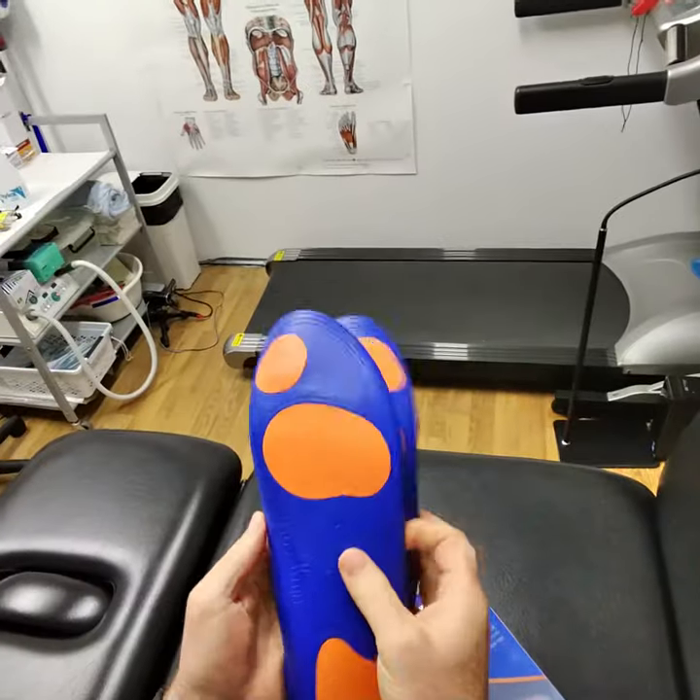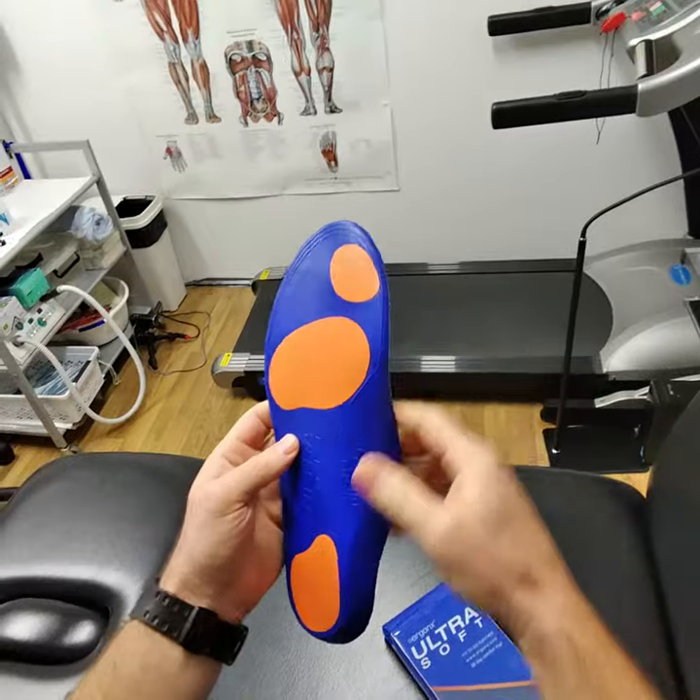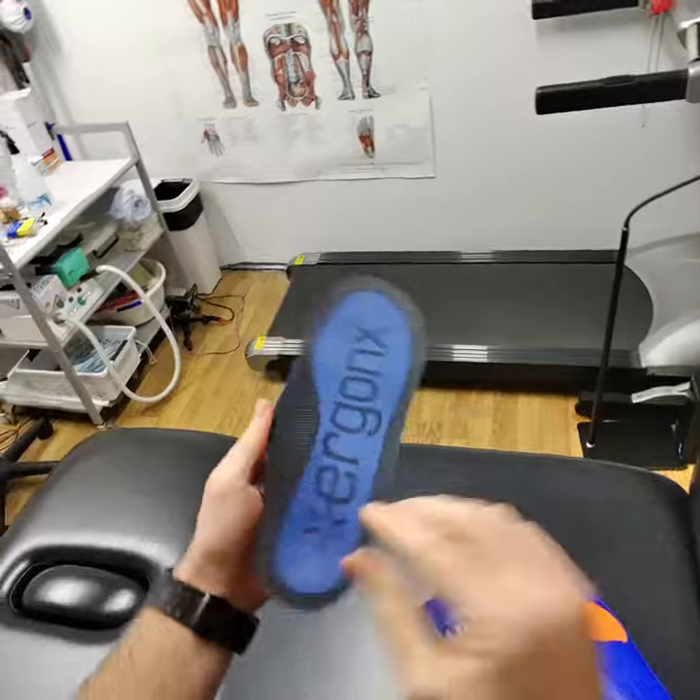You can see they look just like the picture on the back. They've got the forefoot and rearfoot cushioning positions and a really nice long high arch support to help prop up your arch — and that's why we use them in the podiatry clinic.